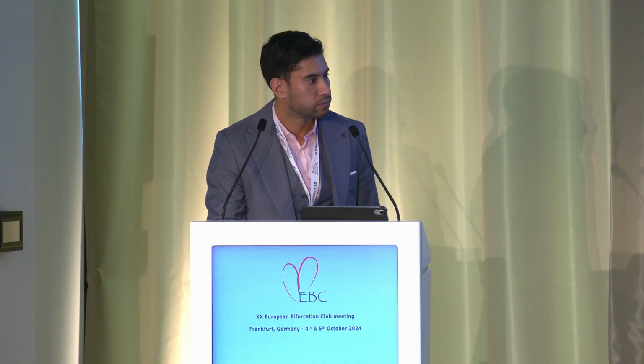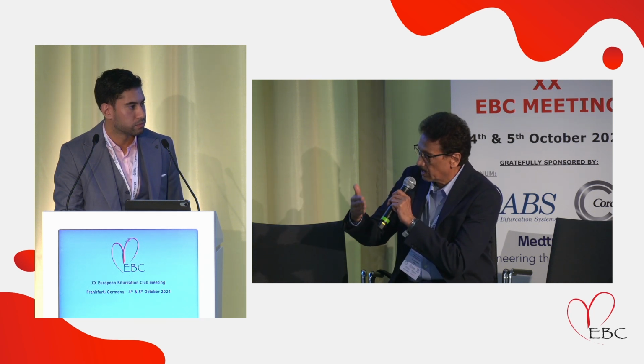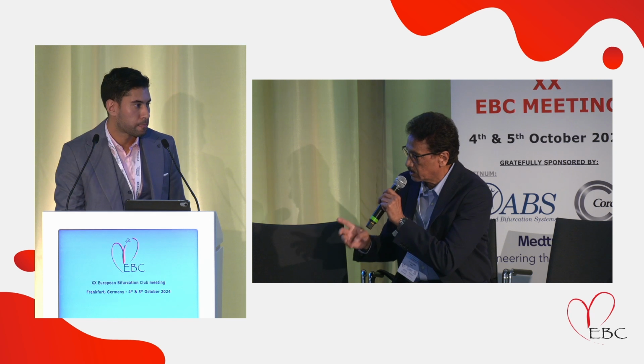My question is very different in the sense that left main bifurcation or trifurcation is totally a different disease, with calcification and things. Here you have 3 rigid tubes. So how do you translate these tests onto a real world scenario where there may be a lesion in the side branches also, and calcification, where you are not able to get good expansion of the distal left main? Would these results reflect real world scenarios as far as the lesions are concerned?